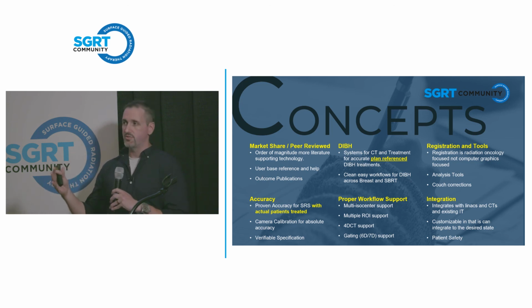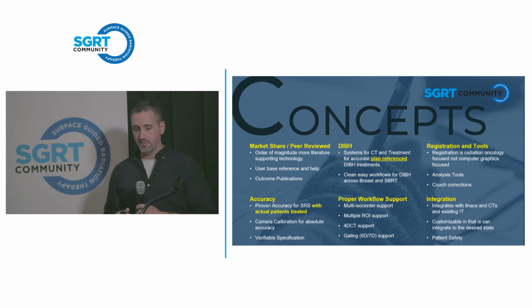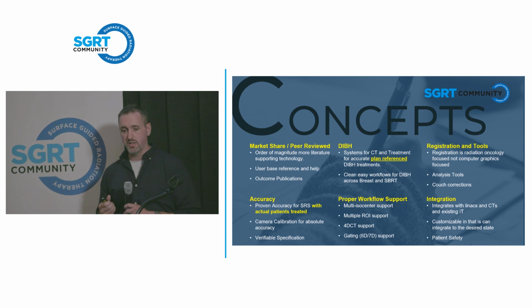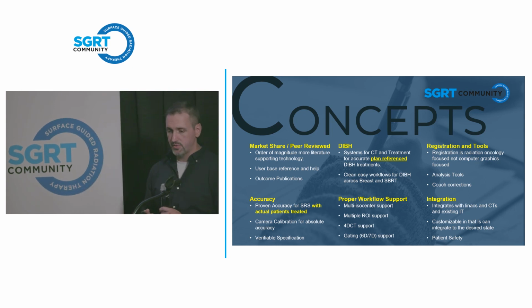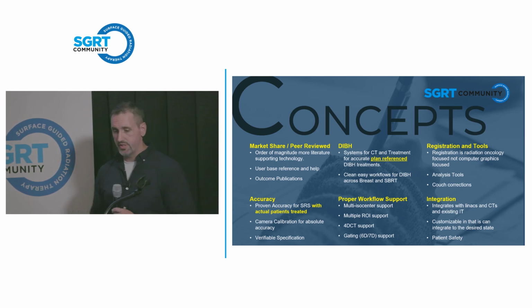So now you need a couch-centered DIBH reference surface, and how does that happen? How do you get that center position at DIBH and not at isocenter? You really need to look at how the vendor handles that, because there are some really clunky and atrocious workarounds that need to happen in some of the vendors' software. So that's up to you to decide whether or not that's adequate for you.